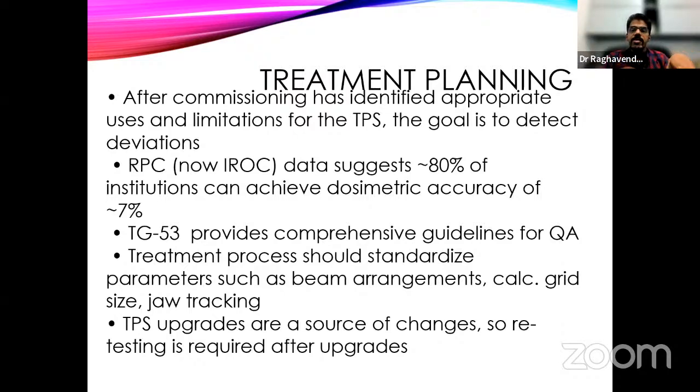To some extent the same thing continues even in the model based system. In a model based system also we have a model. It is like you have a rock, you pour water on the rock, and the water takes the shape of the rock. That is a model: the rock is the model and pouring the water is the modeling process. So this is the adaptation. You adapt the model to the existing data of your system, so here also it depends on your data. Your data measurement should be very accurate so that the model you are going to adopt will also be accurate.